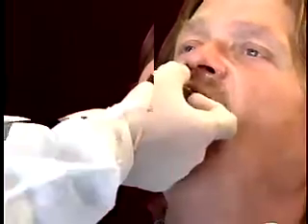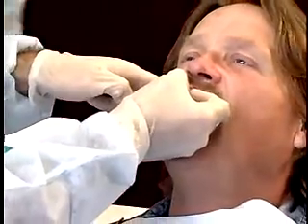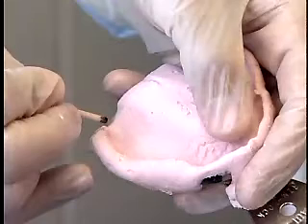Hold the tray in place until the alginate has completely set. Remove the impression from the mouth. Inspect the impression to determine if it is acceptable.